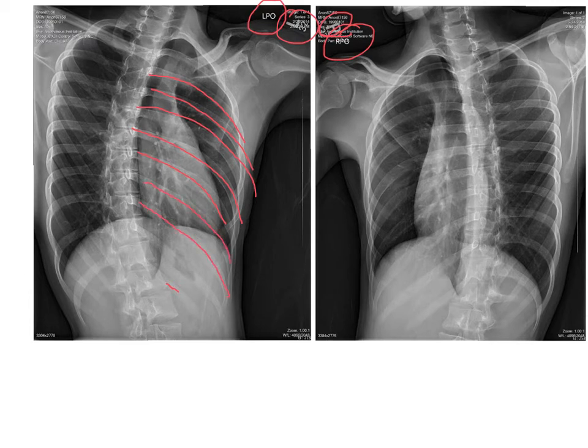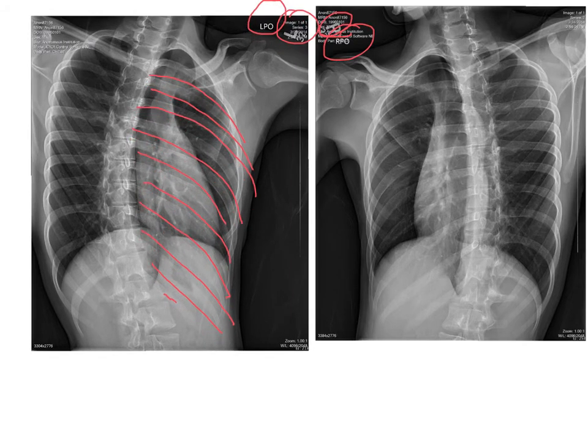We've elongated the left side. Our patient has their left side closest to the IR, and these spinous processes have been pulled out of the way so that we can see these nice elongated ribs.